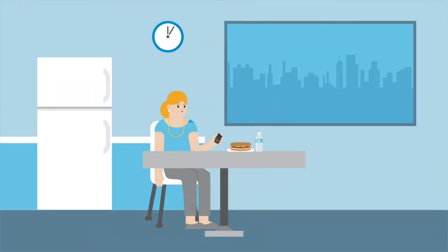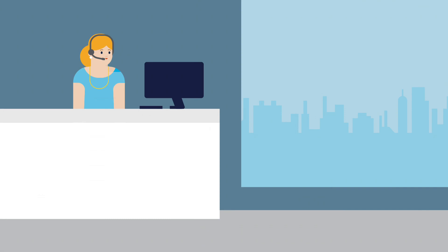Clara's lunch break is over. As she heads back to her desk, Clara feels like she has gotten a little more familiar with her new pump and is ready to meet with her trainer.